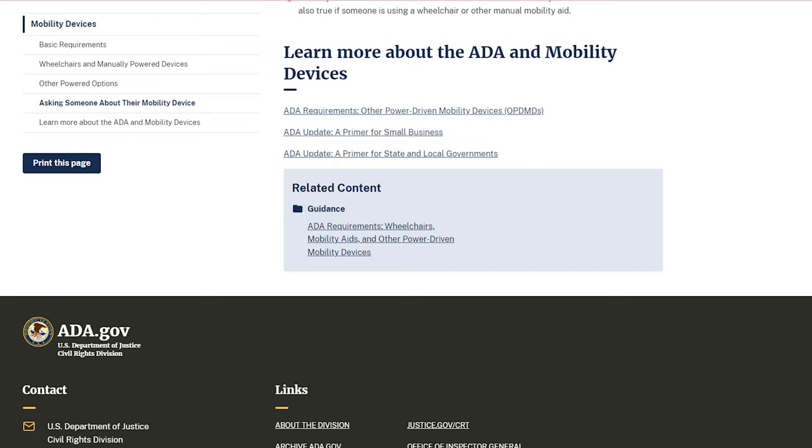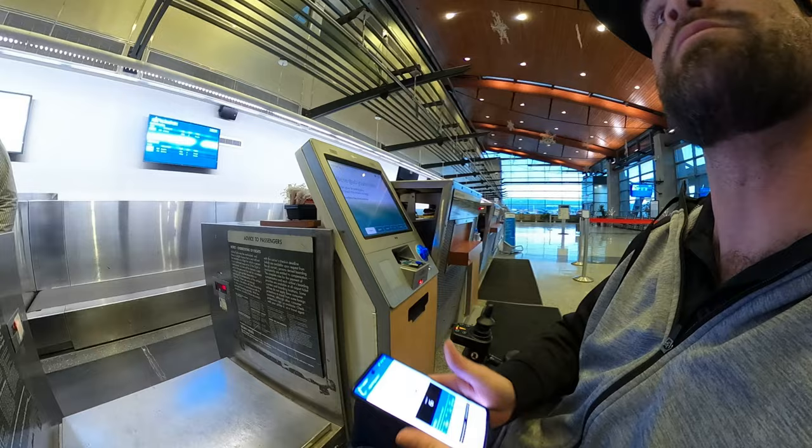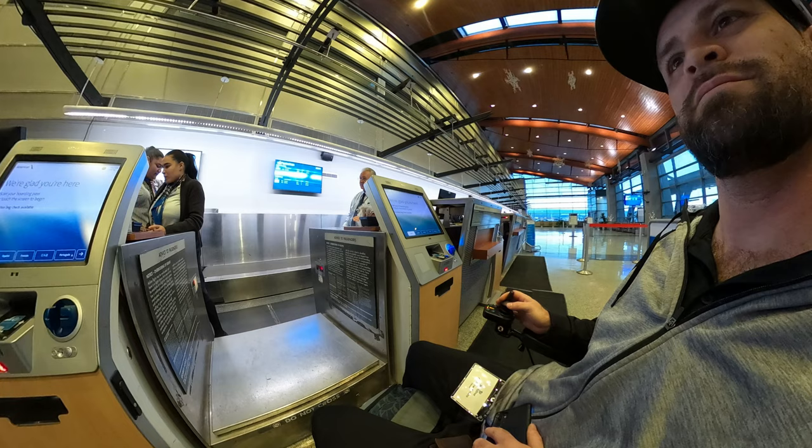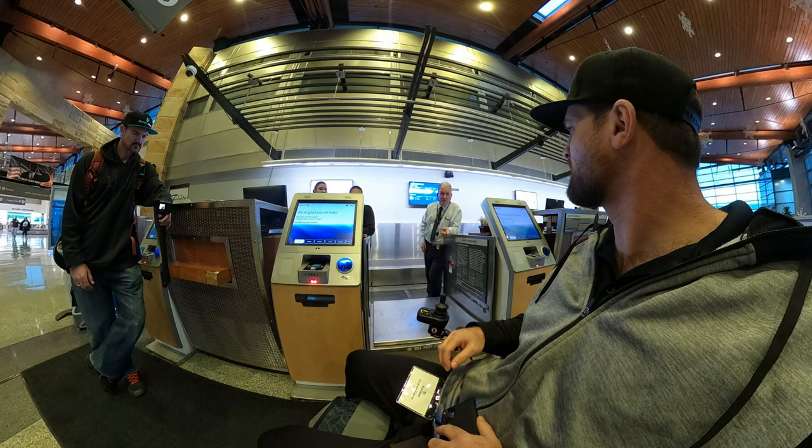And I got to inform them of a couple of different things here. Hello, how are you? Are you recording? Yes, ma'am. That has a lithium battery. It sure does, sir. And I have to declare that. It's under 300 watt hours.